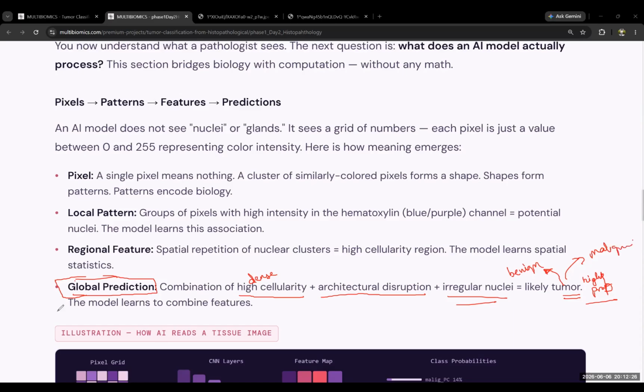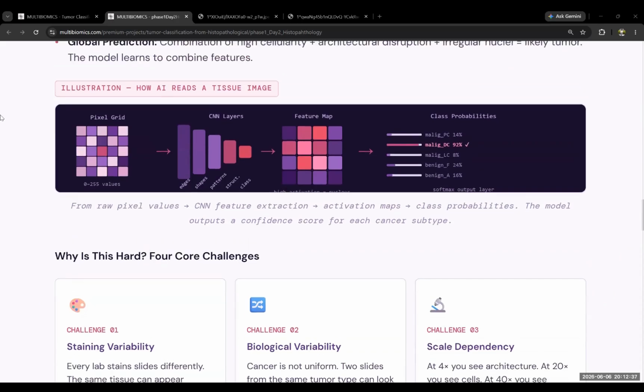Okay. So layer by layer, the convolutional neural network will try to combine the features, and then they will try to learn. So moving on further. This is just an illustration, you see. Here there are some light areas, light pixels, dark pixels. Here you can see more dark pixels.